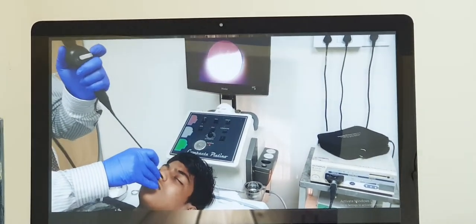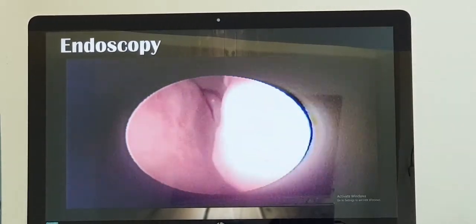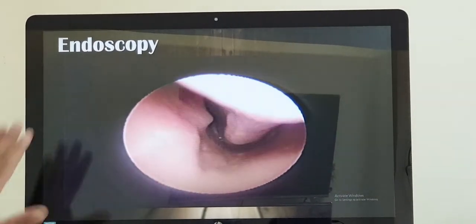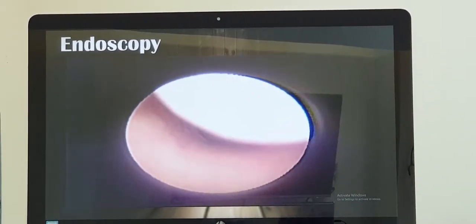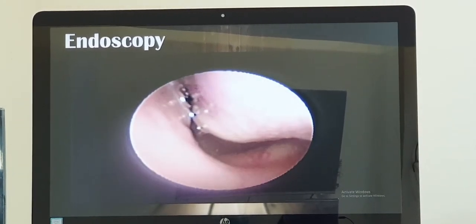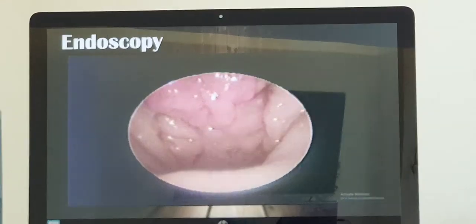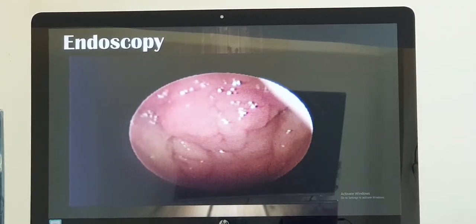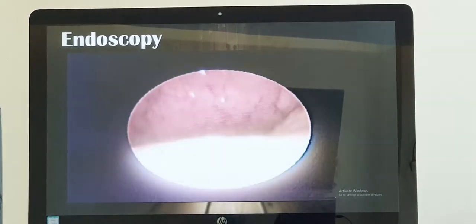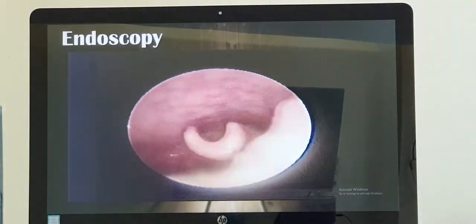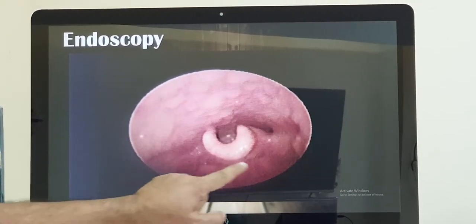The endoscope will now be slowly taken out under vision. I will show you the endoscopy footage alone. This is the nasal cavity, proceeding towards the part behind the nasal cavity. This is the part behind the nasal cavity — the nasopharynx. He is instructed to breathe through the nose so that this part opens up. I proceed down behind the palate. At this moment, he protrudes the tongue so that I can examine these two parts which will open up.